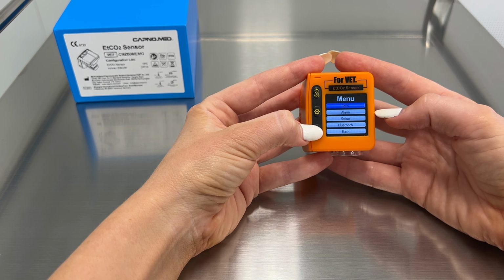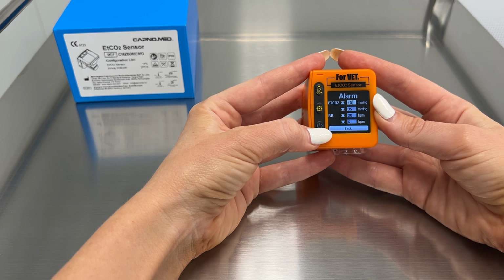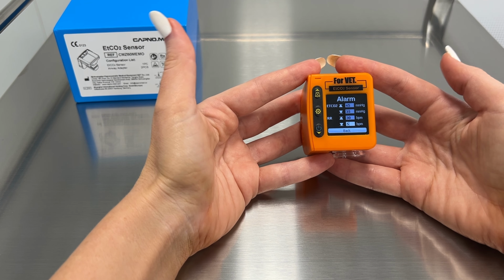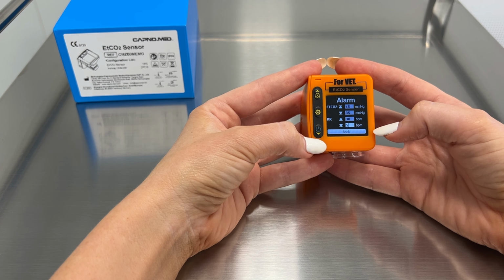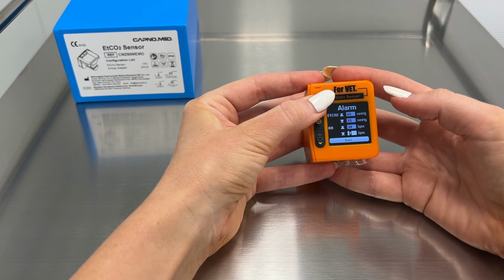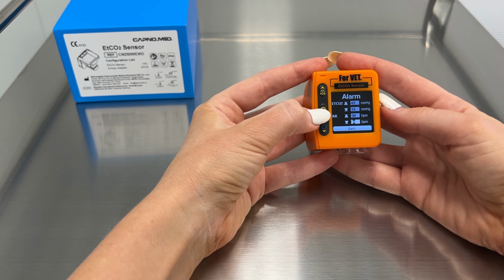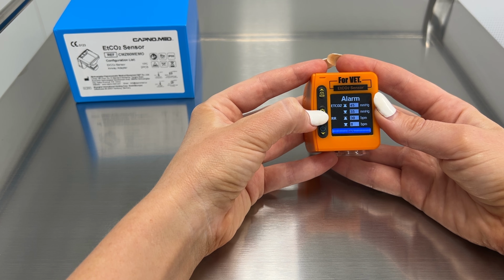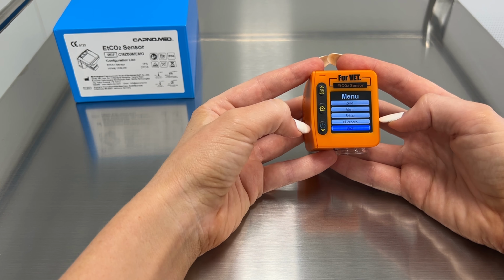So I'm just going to go back to the alarm. And I'm just going to change that. We said about 10 breaths per minute. I'm going to put that to 8. So let's select that. I'm just going to put it to 8. Okay. Down to back and press OK. Now we're back at the menu.